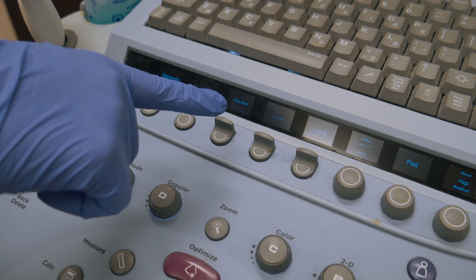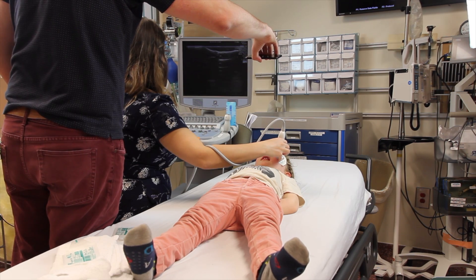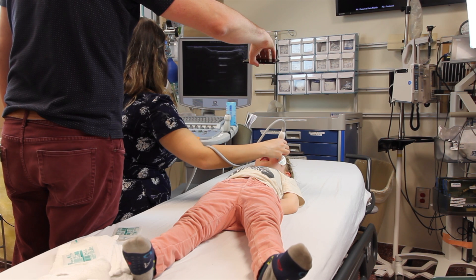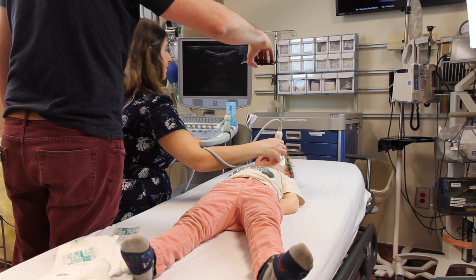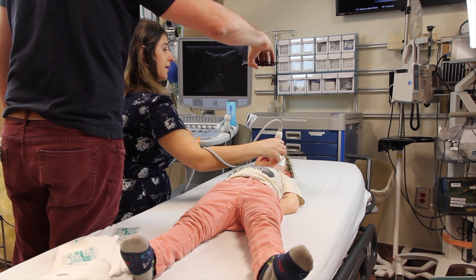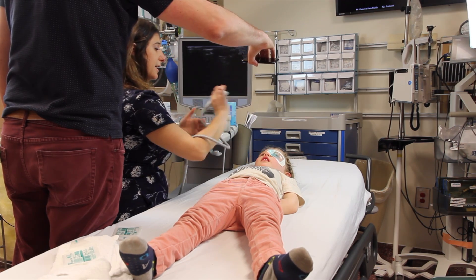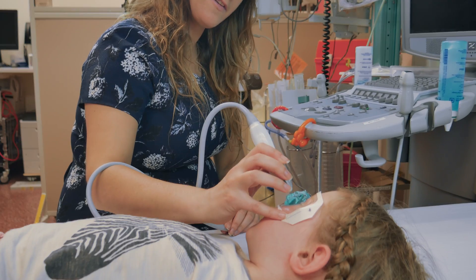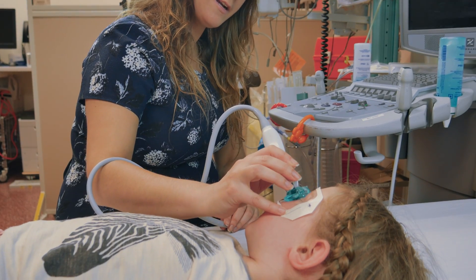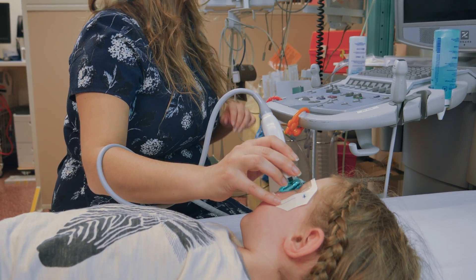It is important to use the ocular preset, because it will have a low thermal and mechanical index. There is a theoretical risk of causing ocular injury, for example cataracts, if the thermal index is greater than 1 or the mechanical index is greater than 0.23. There are two views per eye to obtain for the POCUS ocular scan: longitudinal and transverse.